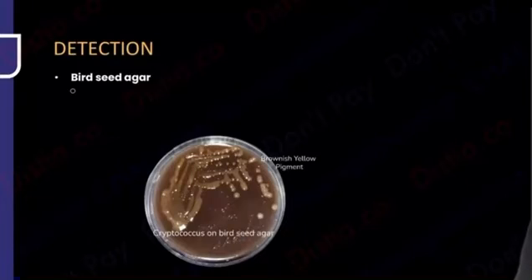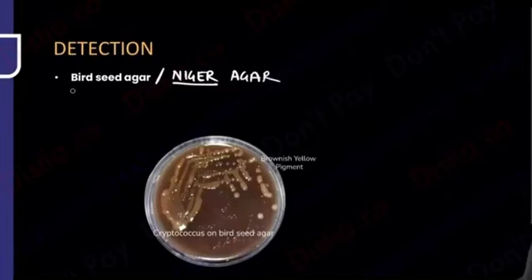So you either call it a birdseed agar or you call it a birdseed Niger agar. And why so? Because Niger word is going to tell you about that brownish blackish color. And this is very famous. I'm not telling you the pathophysiology behind it right now, but this is very famous for Cryptococcus.